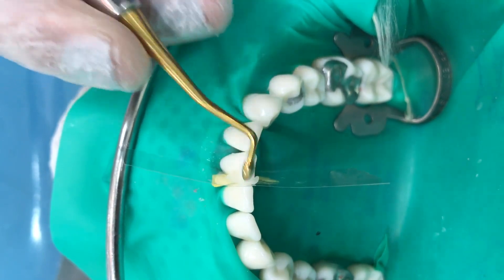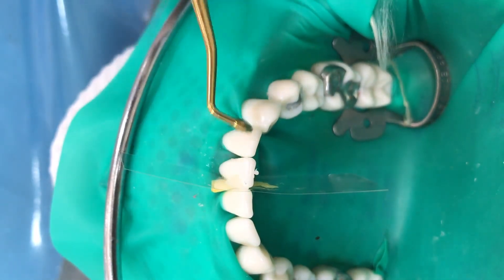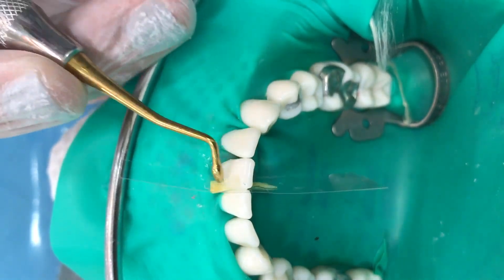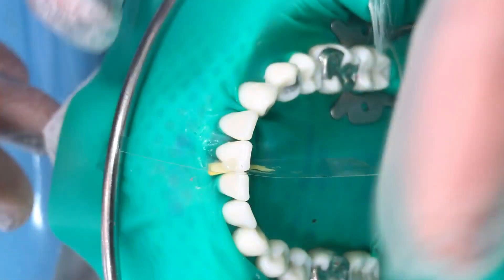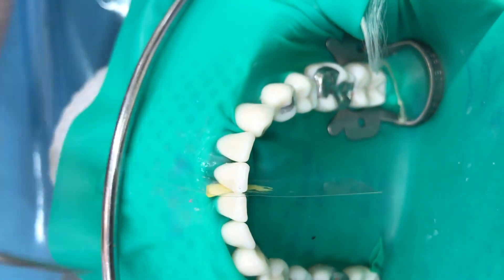While applying composite, make sure that the surface is always smooth, because there's nothing smoother than freshly applied composite. After filling the cavity with the composite, grab the two ends of the mylar strip and wrap them around the tooth of interest. Instantly light cure to get a smooth finished surface.